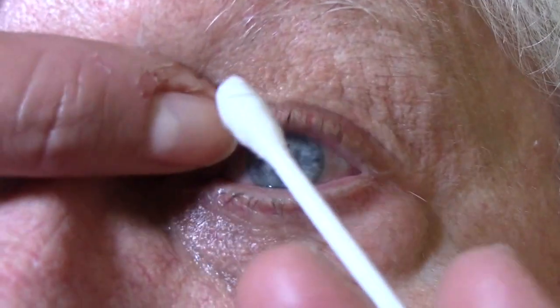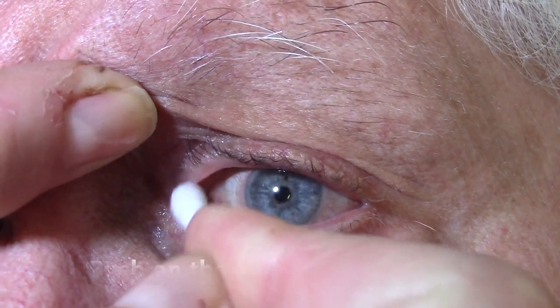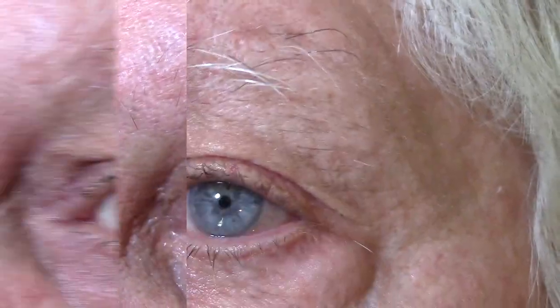So we're going to take our little Q-tip here — turn this way for me, please — and just push a little bit on that plug so it goes back up into the duct. Just a little bit of pressure and it slides right back in. That particular one was difficult for the ophthalmologist to put in; he had to dilate the duct with an instrument and it took him quite a while, so I can see why there'd be problems.